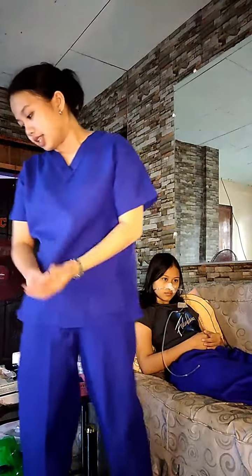So, after explaining, I will perform hand hygiene and then wear gloves again.